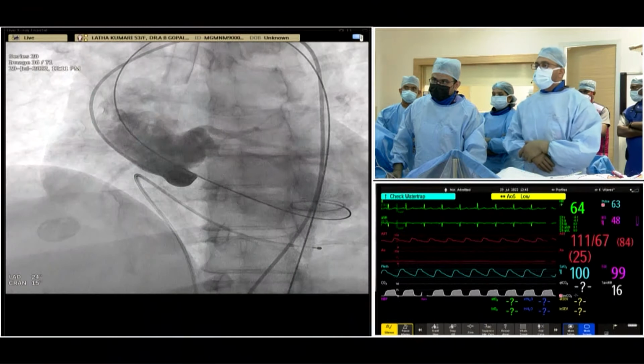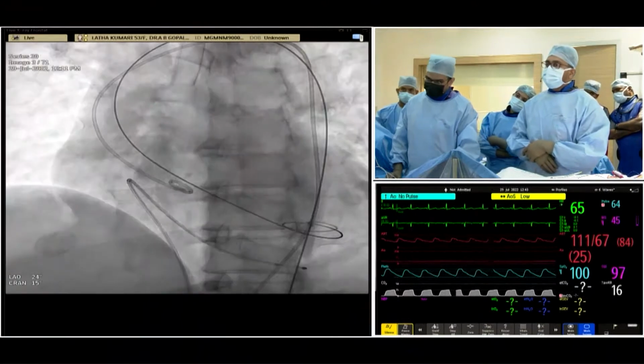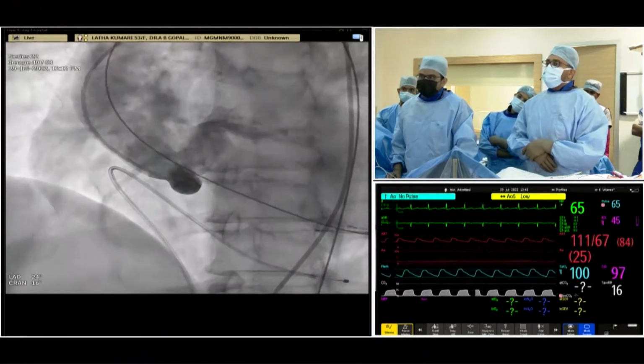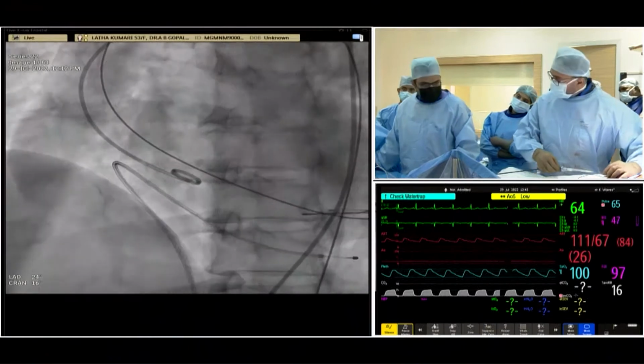Great. So we got a Safari in and show us the implant aortogram, please. So we did some minor adjustments. You can see 3 cusps. So we're happy with this view and ready to proceed. I can take some questions while I get the valve into position.